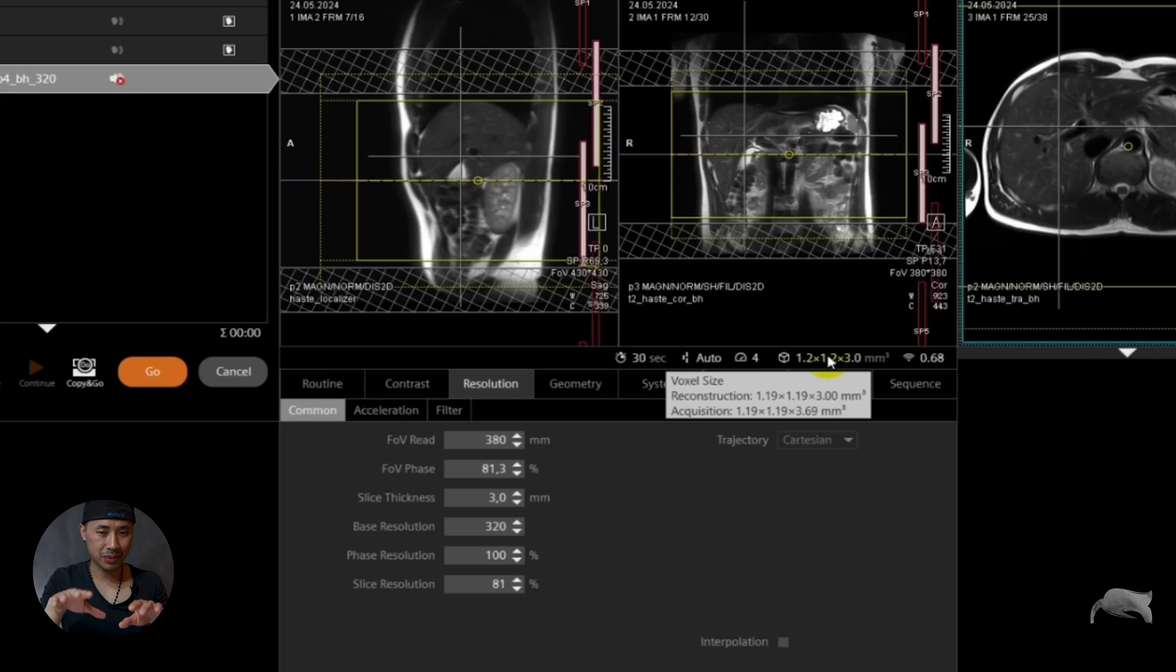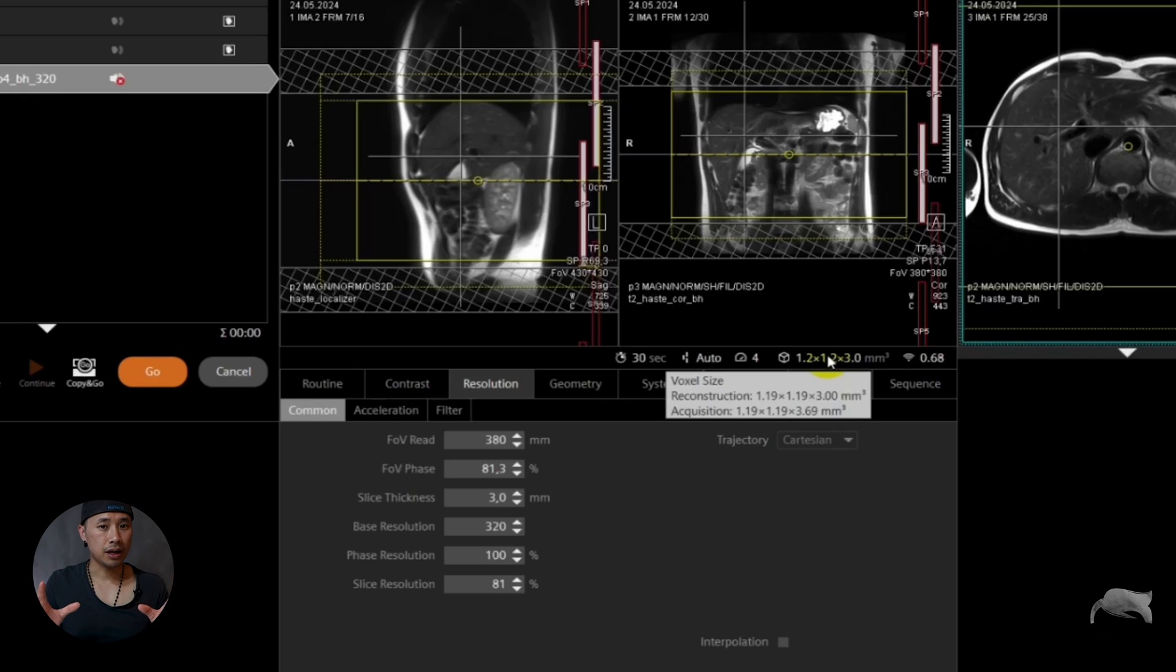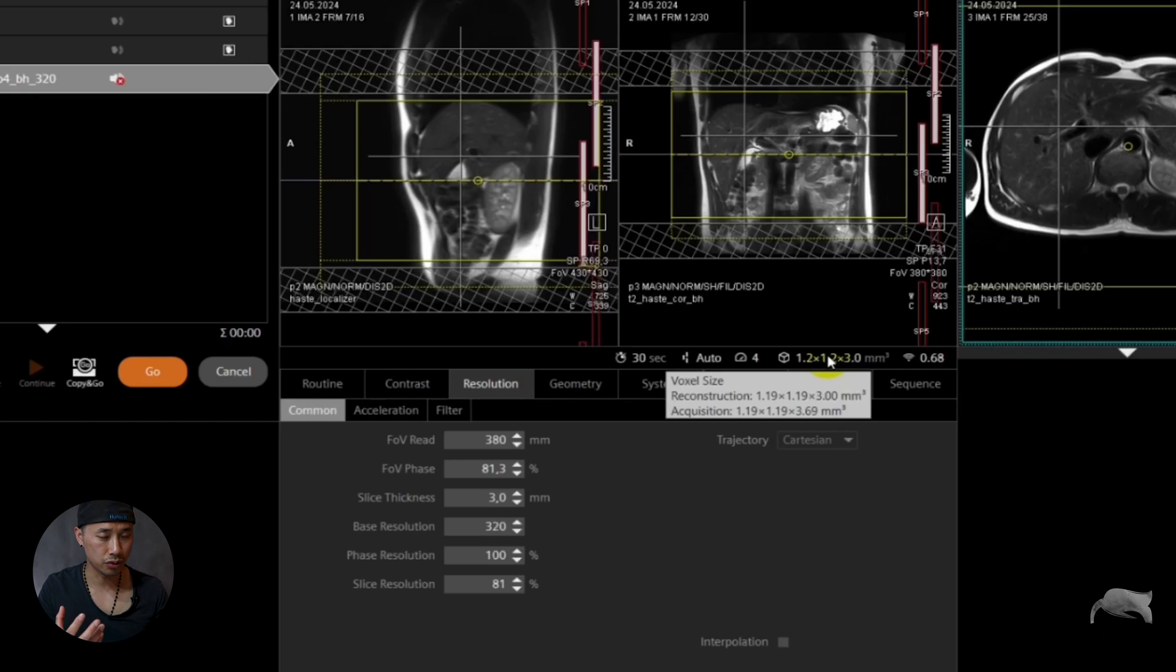Of course we get a very good resolution now. We cut the scan time from 36 to 30 now. So that's how you can manipulate it, but you have to think about the scan time and the SNR. So if you want to have high resolution, that's a trade-off. You need to do a longer breath hold to gain the SNR.